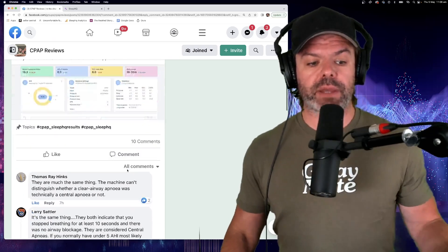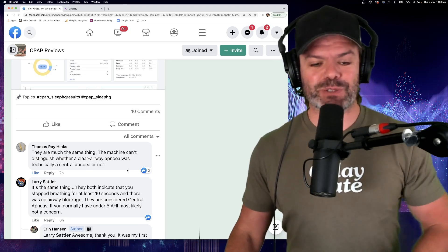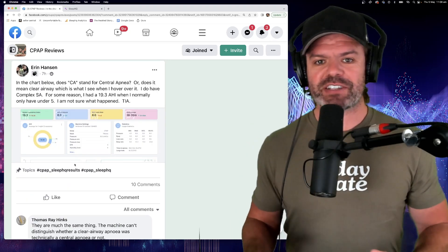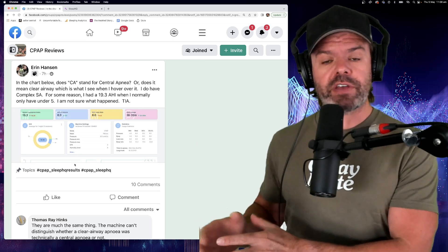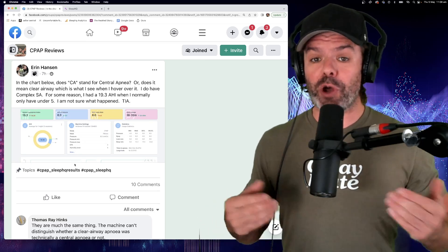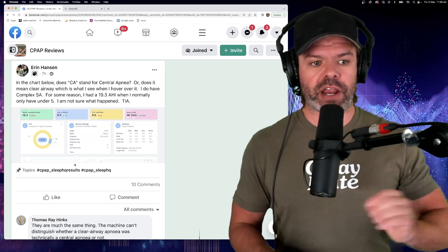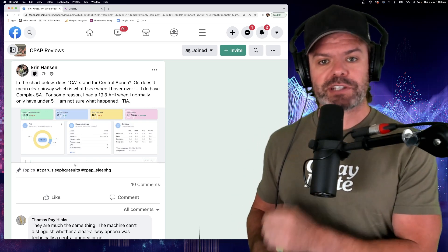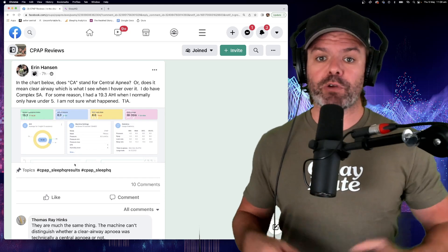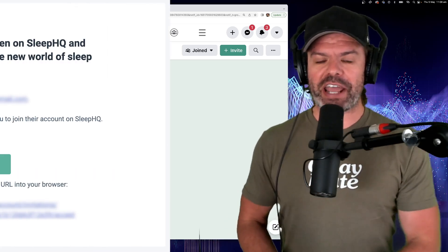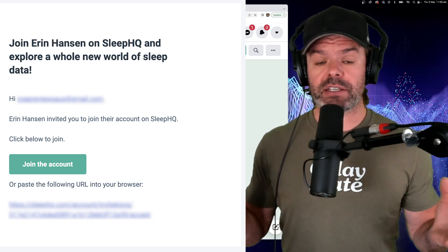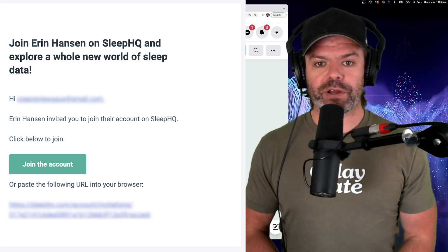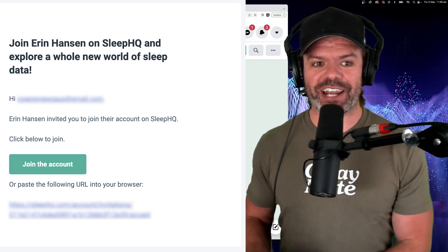You can already see people starting to provide helpful information, which is what's so great. So this totally fascinates me. When someone has an AHI normally under five and then all of a sudden it jumps up to 20, I want to know what's going on. So I shot Erin a message and just asked if she'd invite me to her Sleep HQ account so I could review her data. Five seconds later, I got an email link, clicked on the link and I was able to see exactly what was going on with Erin's data. All right, let's head over to Sleep HQ and check it out.